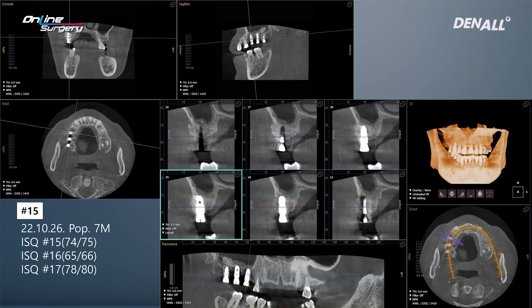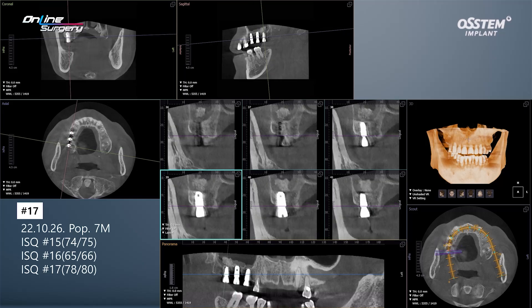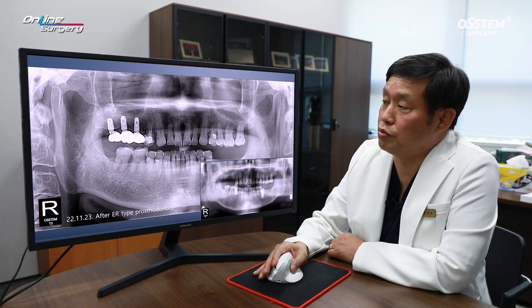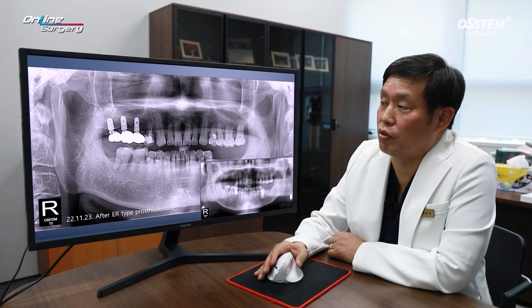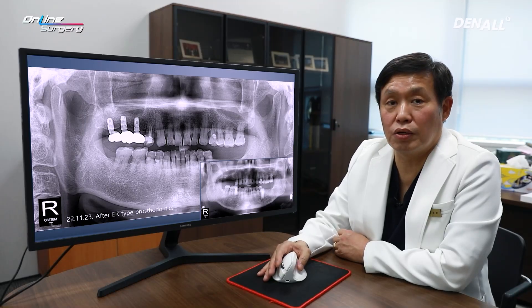When ISQ was measured at post-op seven months, for number 15 the ISQ was 74 and 75; for number 16 it was 65 and 66 — the graft is stabilizing, though there is a bit of mucosal thickening within the sinus. For number 17, the ISQ values were 78 and 80, which were quite favorable. The graft material that was positioned posteriorly was resorbed. After that, the final prosthesis was delivered — ER type — and up until now no major problems have arisen. Long-term follow-up is necessary.